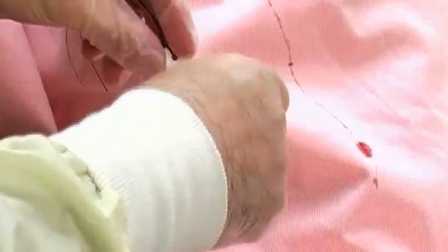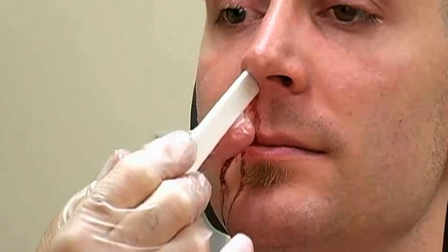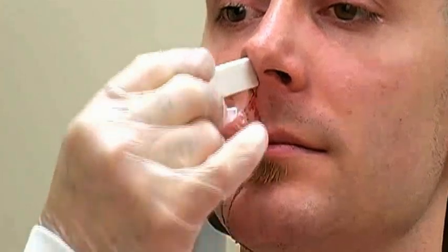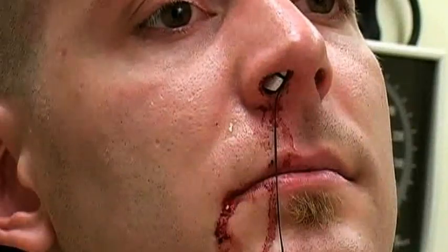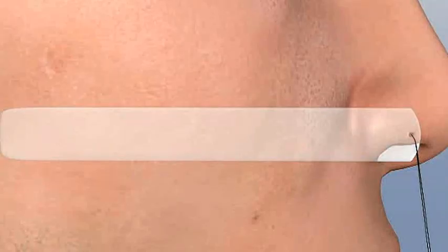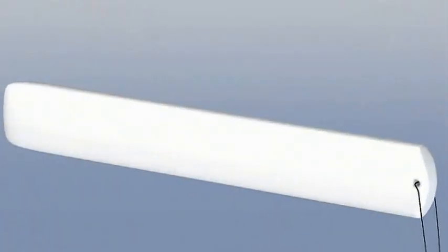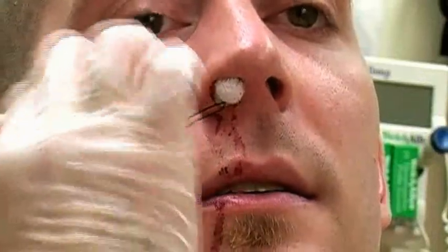The larger sponge, which is indicated for more substantial hemorrhages, is inserted in a similar fashion. It may be trimmed with scissors if it appears too long. First, lubricate the device with a topical antibiotic ointment. Insert it into the nares at a 45 degree angle for one or two centimeters, then bring it perpendicular to the face and advance it fully into the nasal cavity. Once inserted, rehydrate the sponge with three to five milliliters of saline solution. Because this sponge is inserted deeply into the nose, insertion will be uncomfortable unless adequate topical anesthesia was obtained as described earlier. To secure the device, fix the strings to the cheek using tape or transparent dressing.